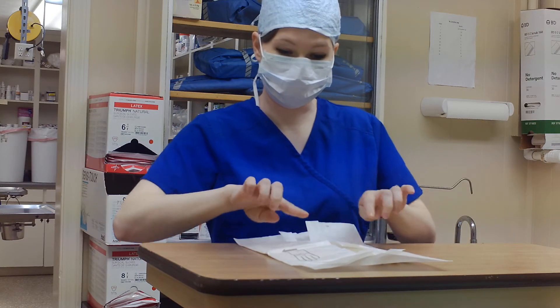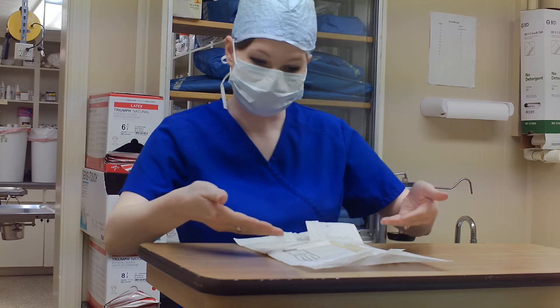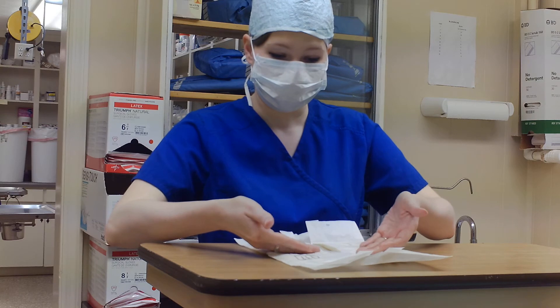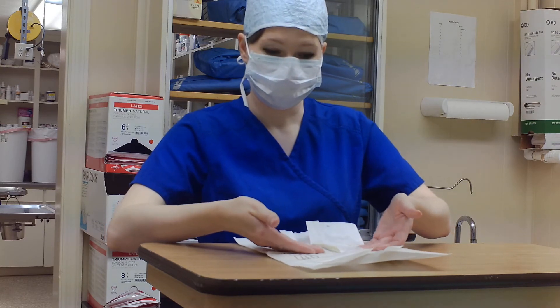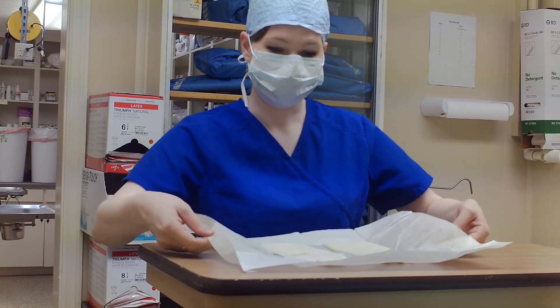And there are little folds that fold outward — those parts you can touch as well. Do not touch on the inside. So I'm going to pick these up, these little folds, and just pull it backwards.